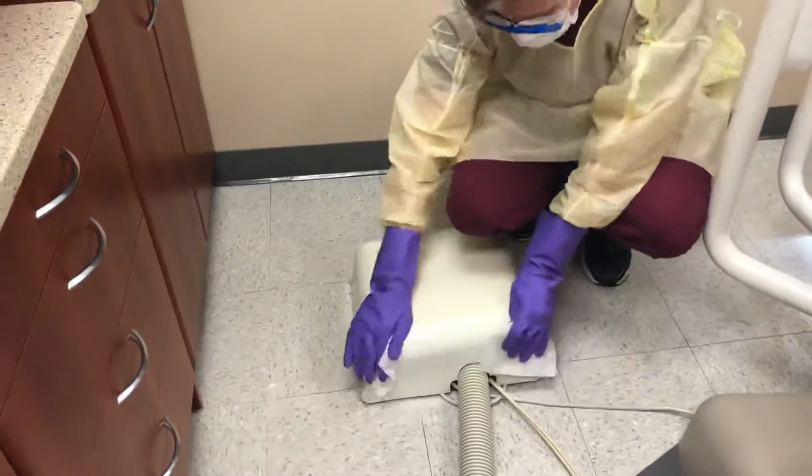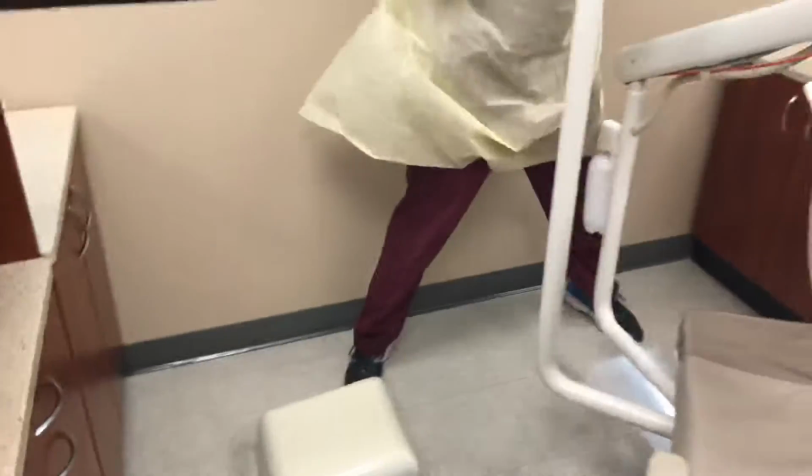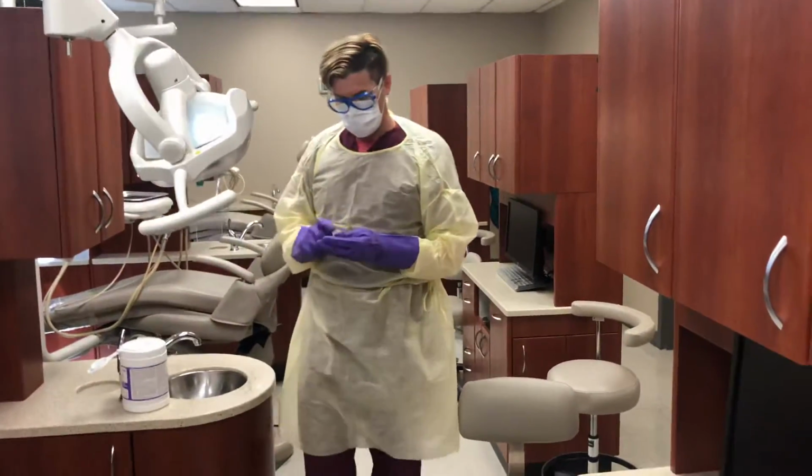This is the cord box. We do not have a personal storage container, but you would be wiping all of that, top to bottom and sides. And any other surfaces that need cleaned.